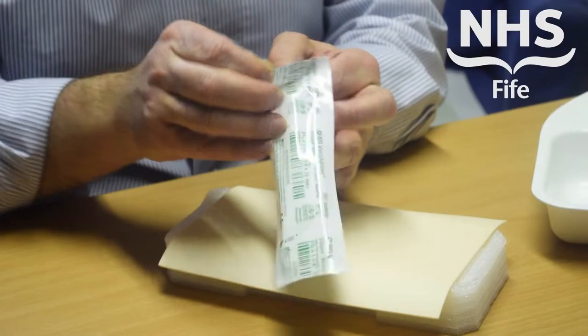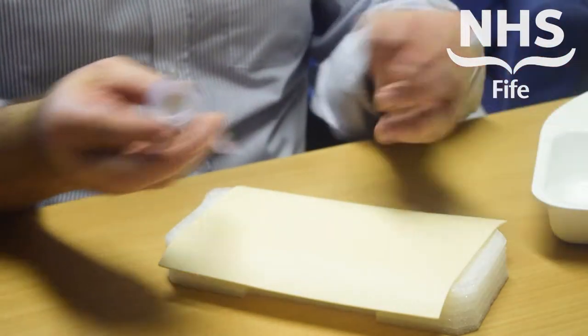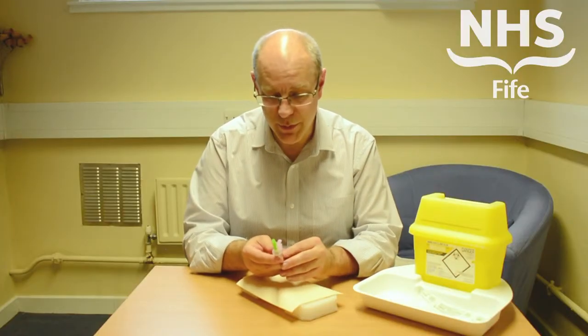To use the device, simply open the package. The device can then be removed. The plastic packaging can be disposed of later into your normal domestic waste — there's no need for that to go into the sharps bin.